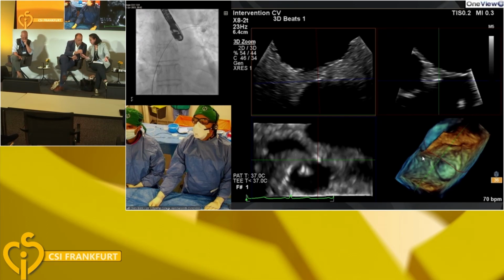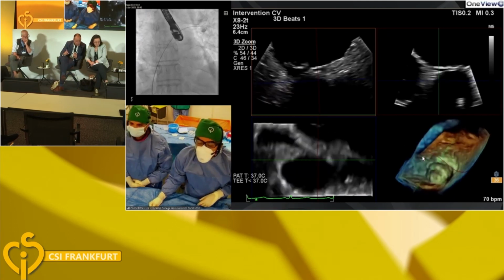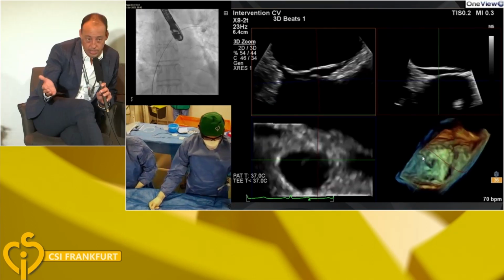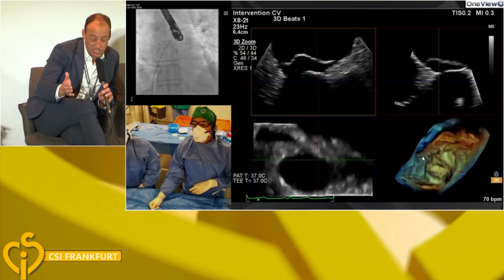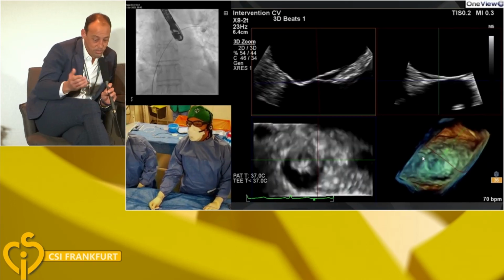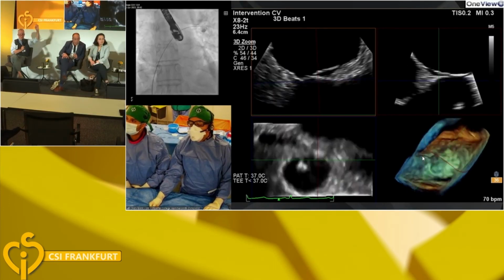I mean, Bushra's got beautiful images here. Yeah, beautiful image. I think there's a clear aneurysm. I think the choice of device will be interesting here. I'm not sure that I will choose a PFO occluder in a case like this. I will certainly balloon size and potentially select an ASD occluder in a case like this, but I would be happy to see the opinion of others. Hands up everyone who will balloon size this. Got a bit more to add in terms of the imaging.